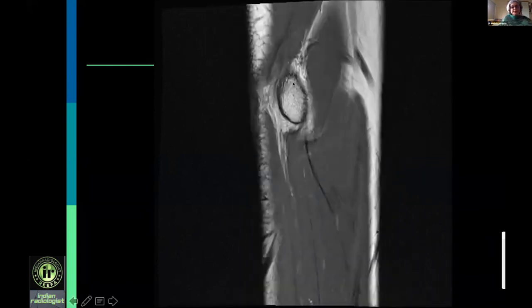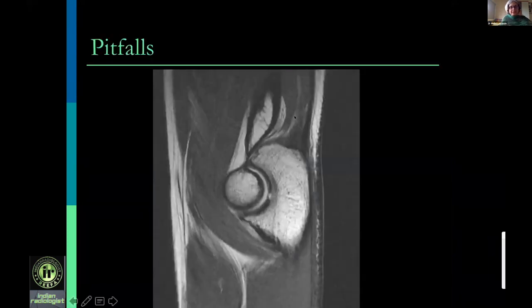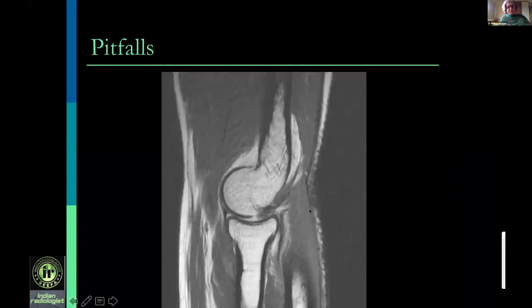Coming more medially on sagittal, the ulnar collateral ligament and common flexor origin are visible. Sagittal images allow viewing these ligaments but they are primarily assessed on coronal and corroborated on axial. Key pitfalls: the trochlear ridge should not be called a cartilage defect. Similarly, the dorsal capitellum should not be called a cartilage defect — it is because the capitellum transitions from a circular shape to flat at that point, which is entirely normal.